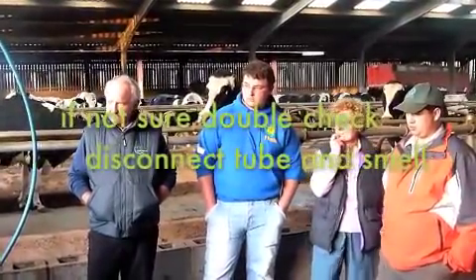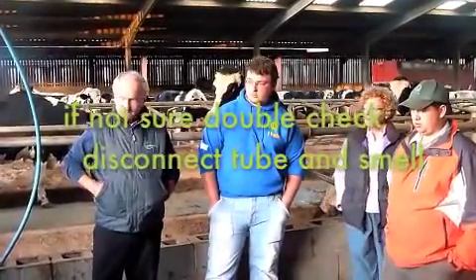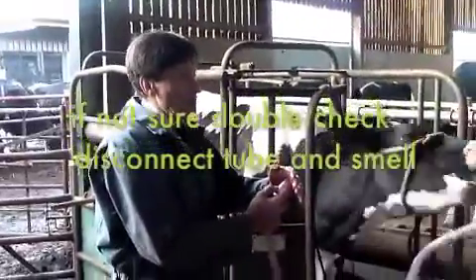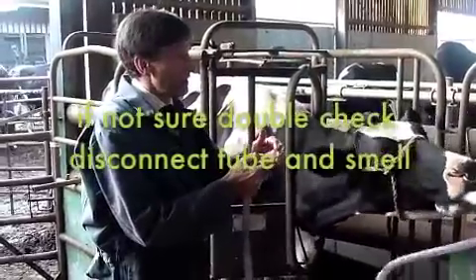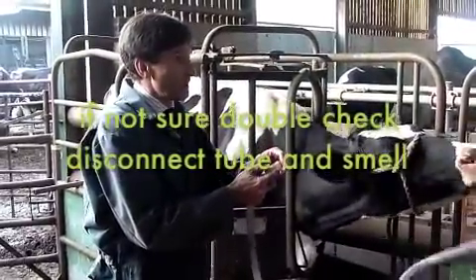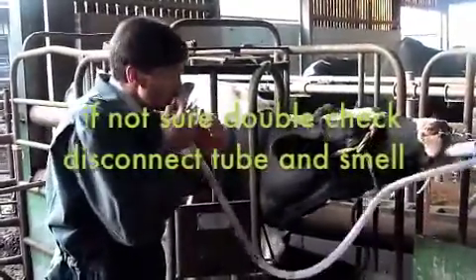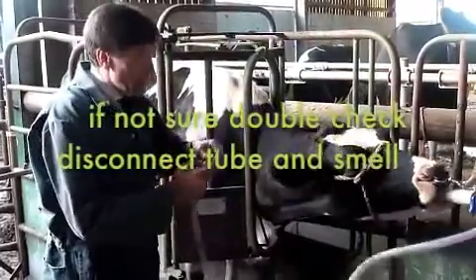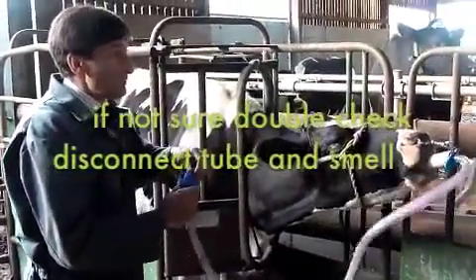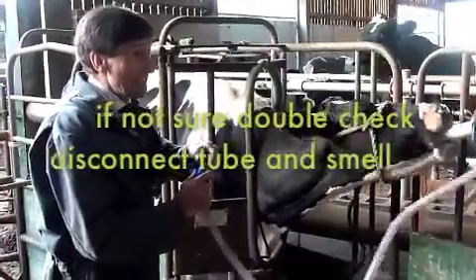If you're not sure, the other thing you can do is unfasten this end, because I can tell you — I've put it down a cow's airway once, and you can feel her breathe, literally. You can feel them breathing through here. You can usually smell the ruminal contents as well. Personally, I like to feel it best of all, because if you can feel it in the jugular groove, it's there and it's not inside the airway.